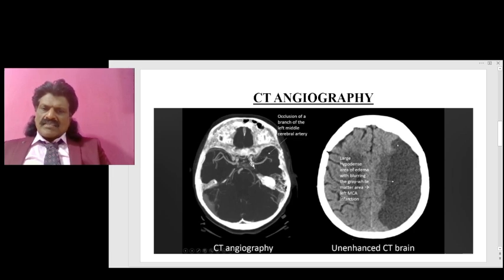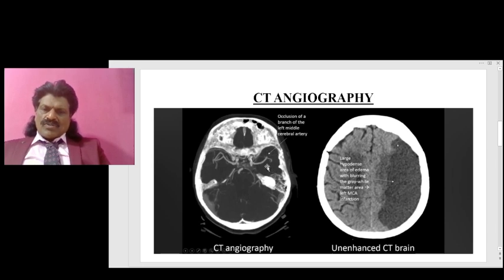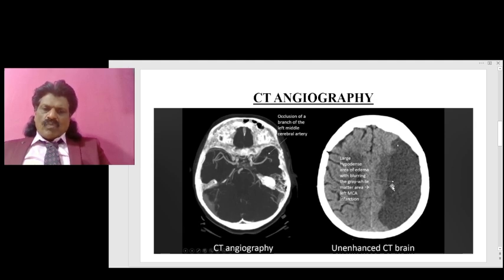Here you can see the MCA is well seen on one side, but there is an occlusion of the MCA on the other side. When we follow up with an unenhanced CT scan, there is a large hypodense area of edema with blurring of the gray and white matter — a left MCA infarction resulting from occlusion of the MCA territory, which is well picked up by CT angiography.